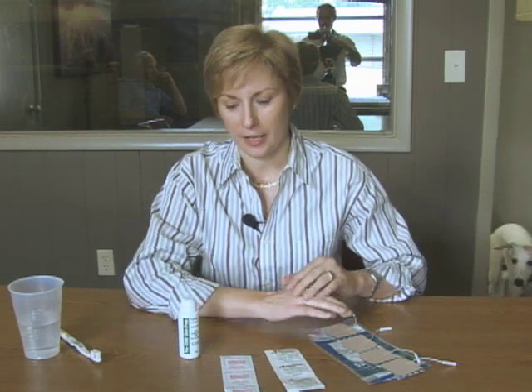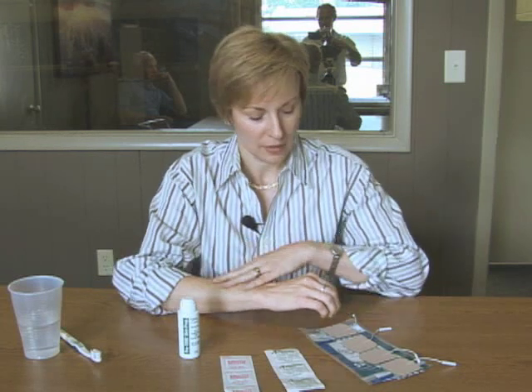First of all, you want to make sure whatever area you're going to be using your electrodes on, the skin is clean and dry. And if you are a very hairy person, you may even want to consider shaving the hair to remove it so that you get better stimulation. That hair is going to cause an increase in resistance.